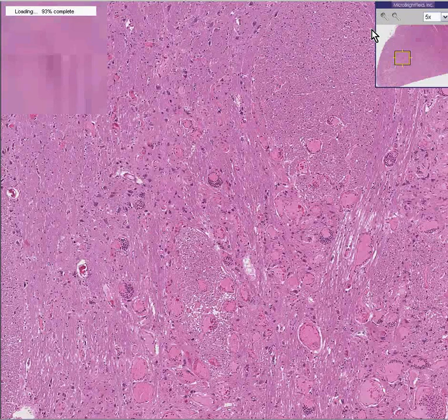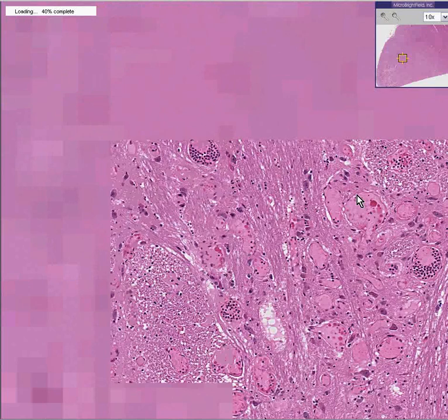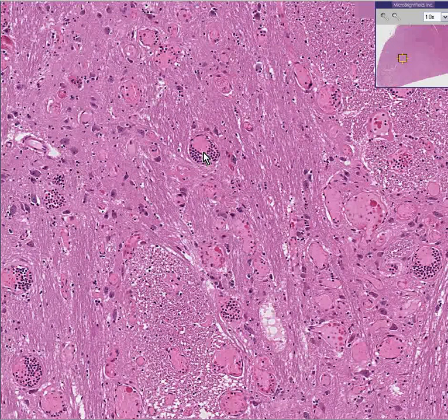I wish that this computer would allow us to more quickly zoom in on areas to show you that these are really nothing but blood vessels. You can see blood inside of them. You can see white cells inside of them. You can see that part of it involves areas where there are a lot of neurons, and part of it involves primarily myelinated tracts. This could very easily be very seriously symptomatic in this area.